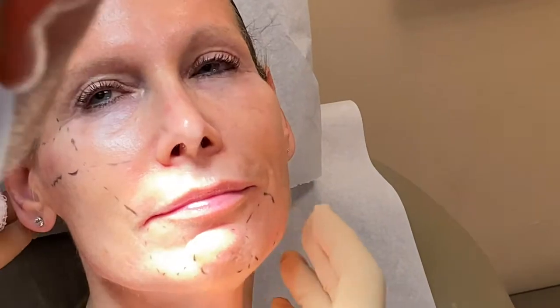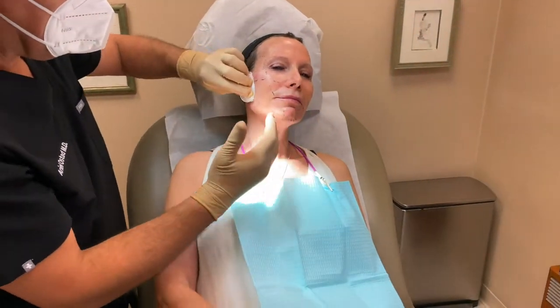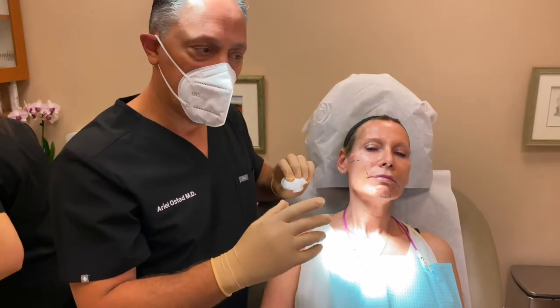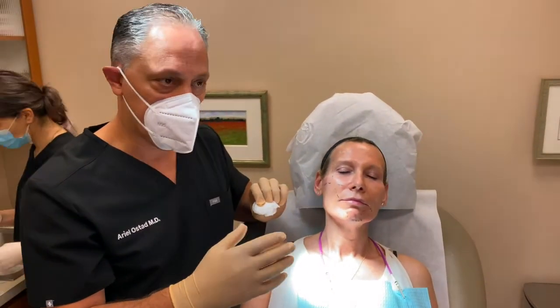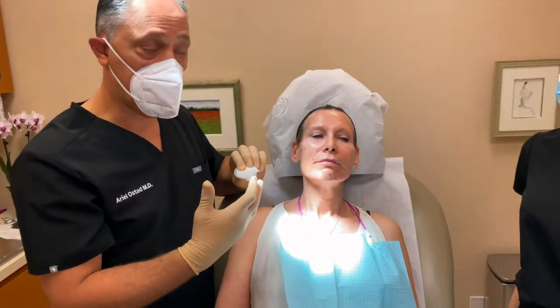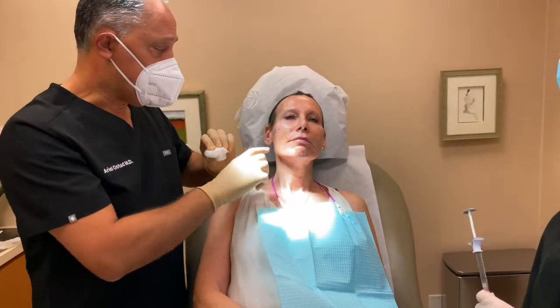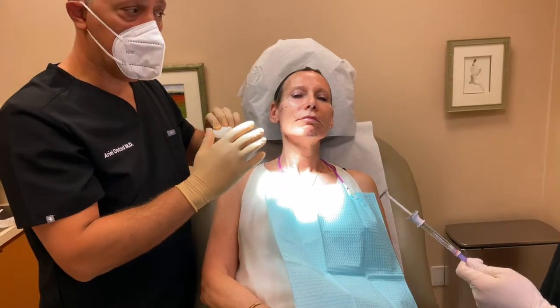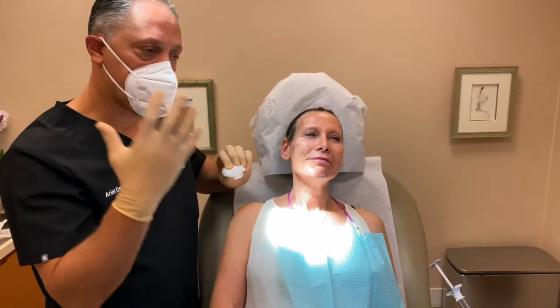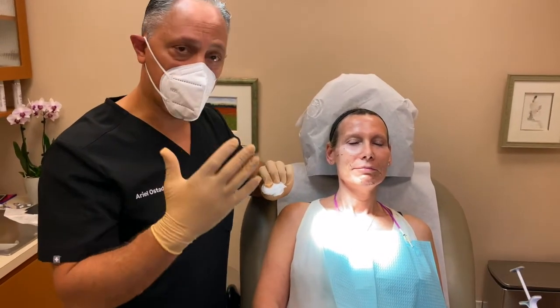Let me see. I love your results. So we're going to just make sure, and again, one of the other things that is important is that no one's ever symmetrical. And that's why we don't follow a cookbook approach. It's not necessary to put the exact same amount. You really look at a patient and you see whether they need another syringe. In her case, I'd love to put a little bit more in. We always find the side that people sleep on tends to need more filler, because of the effects of compression from lying on that side regularly, there's loss of fatty tissue.